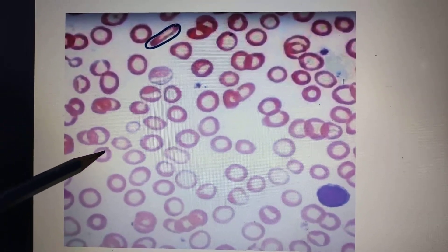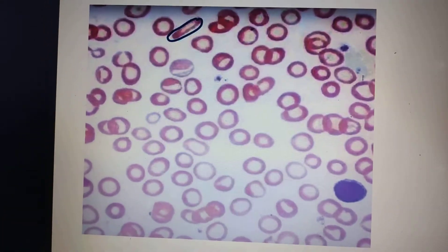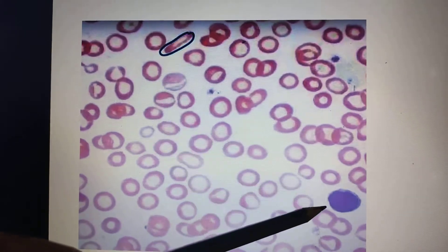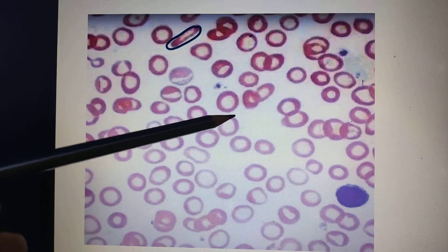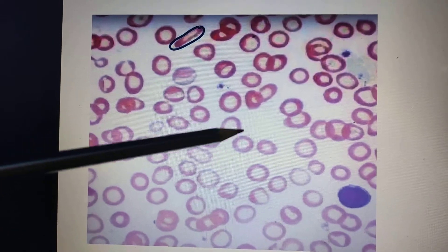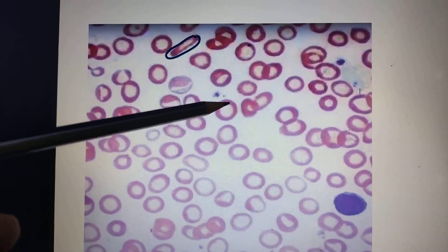The lymphocyte and the RBC size are almost similar, around seven to eight micrometers. In this image, the lymphocyte appears to be bigger — but actually the lymphocyte size is the same; it's the RBC size that is reduced. Along with this, if you see the central clearing, it has been increased.